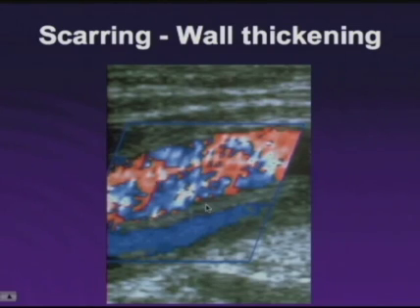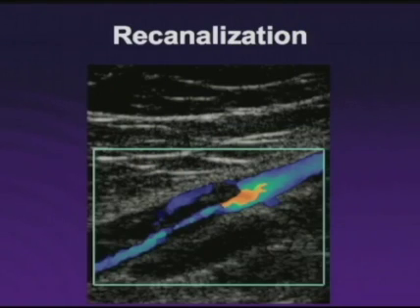The artery is above here. We can see the aliasing, and the striking finding here is in the vein, which has a blue lumen, but you can see that the wall of the vein is thickened on both sides in a very uniform pattern around both the anterior and posterior aspect of the vein, indicating a circumferential wall thickening, again the result of prior recanalization. Recanalization in process can also be seen, and also seen in part of retraction here. We can see the residual lumen forming around the vein as well as around the edge of the vein.